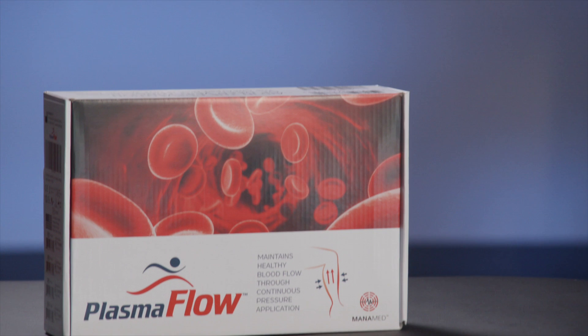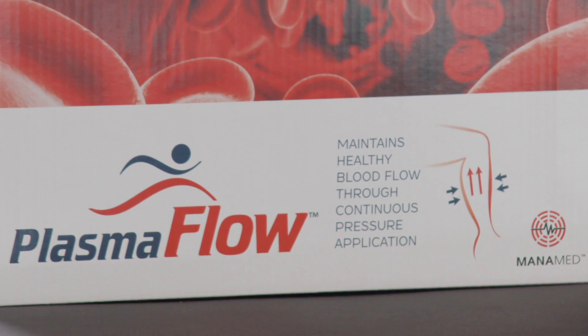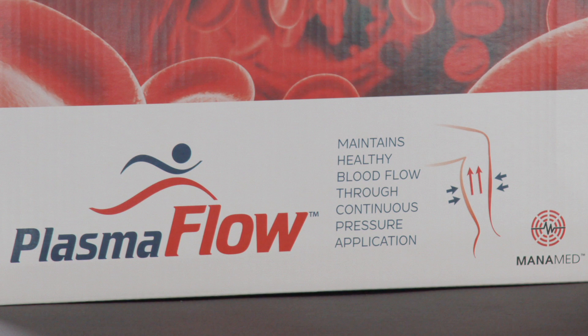The PlasmaFlow Model PF0001 is intended to be an easy-to-use portable system for use in the home or clinical setting to help prevent the onset of DVT in patients by stimulating blood flow in the extremities.